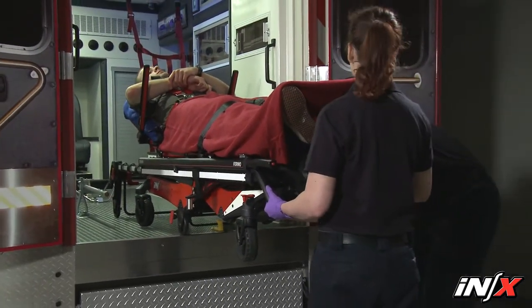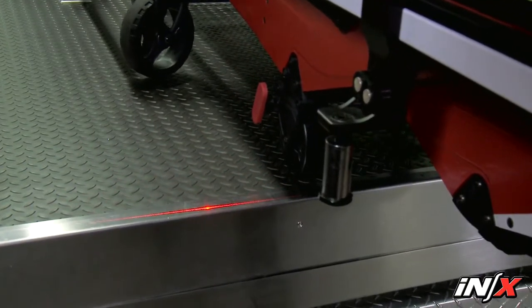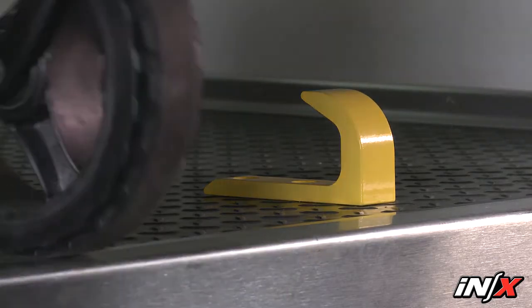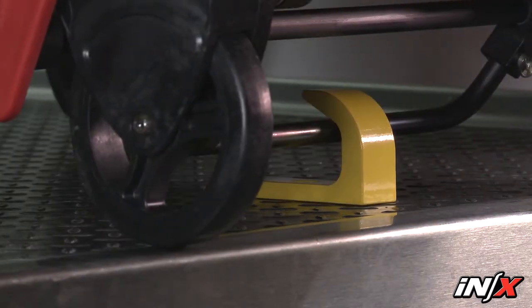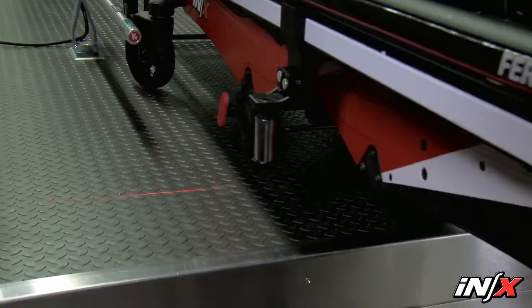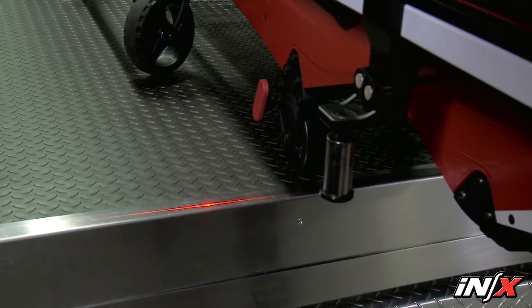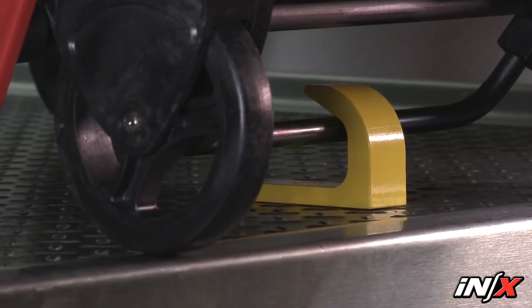Support and balance the weight of the NX and patient as you proceed, and watch for the position indicator lights on the ambulance floor. Guide the NX towards the safety hook so the hook will be captured by the center of the intermediate safety bar. Stop rolling when the NX is engaged with the safety hook and the position indicator lights align with the edge of the ambulance floor. Visually confirm that the safety bar has been captured by the safety hook.